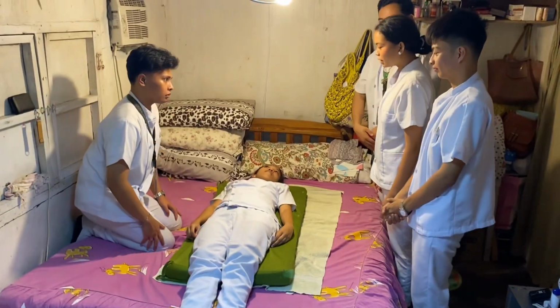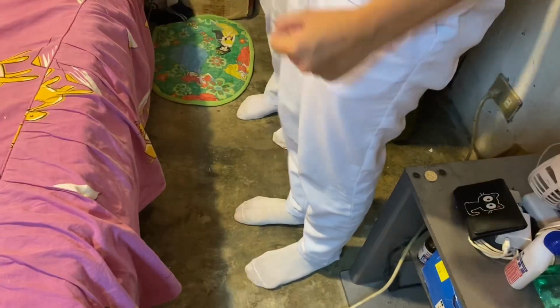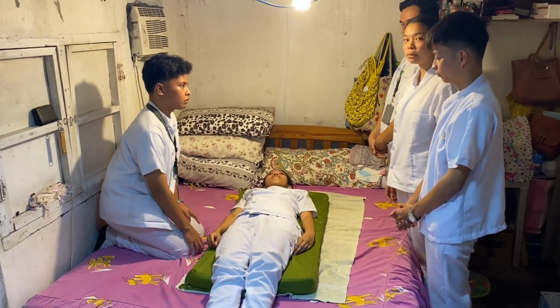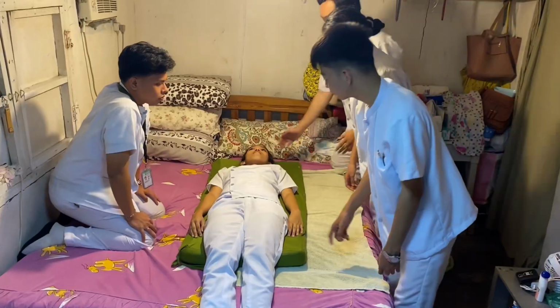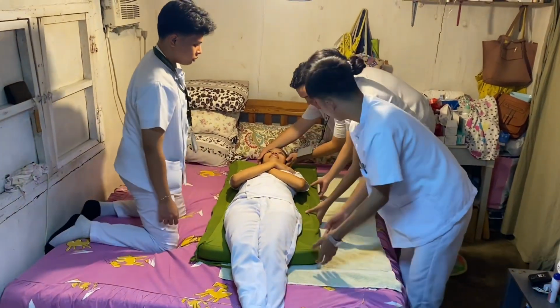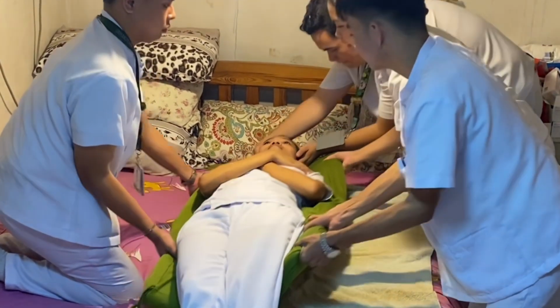On a planned command, the caregivers on the stretcher side will pull the patient, shifting weight to the rear foot, while the caregiver on the bedside will push the patient towards the stretcher, shifting weight to the front foot. On 3. 1, 2, 3.